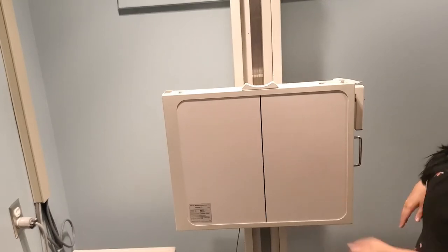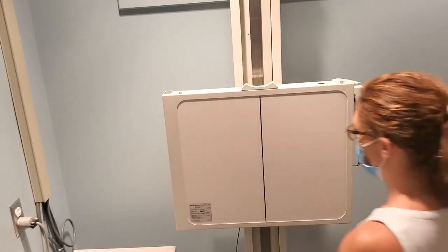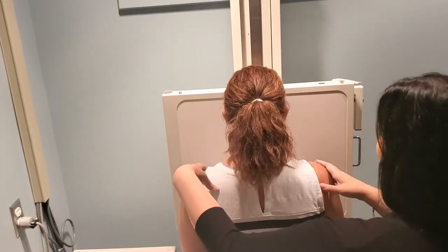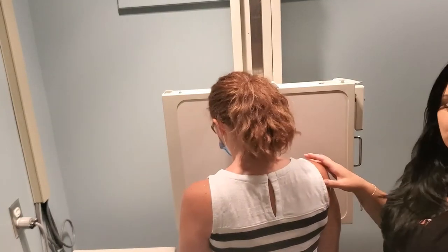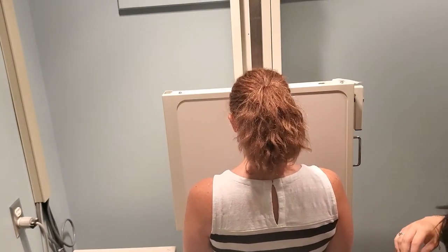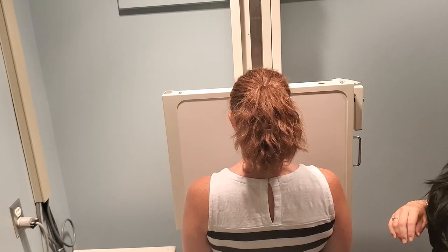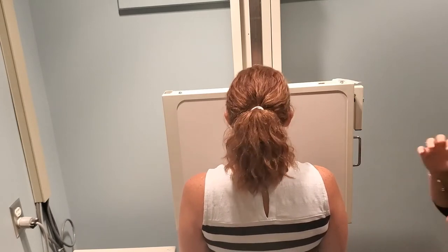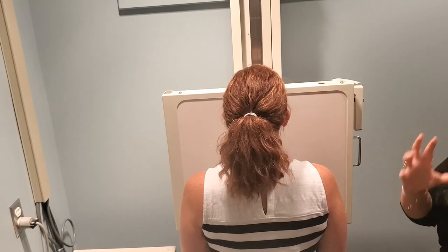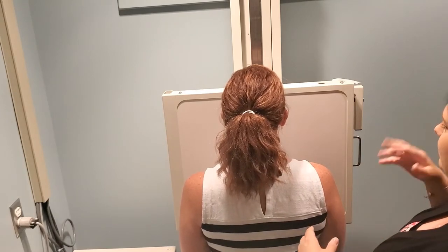The patient comes in facing towards the board and we're doing the right shoulder today. The rotation for this projection is 45 to 60 degrees, and this image can be really hard for students when they're first starting out because it is such a big variance. It's totally based on body habitus, but there's a trick that can help when you're first starting out.